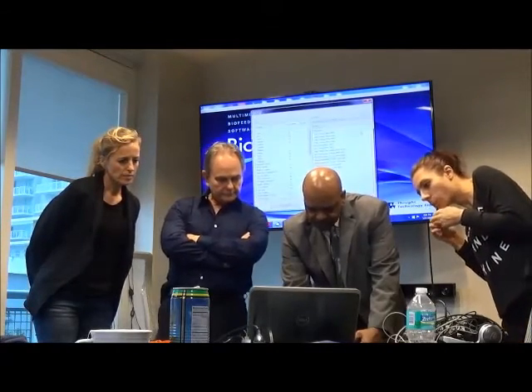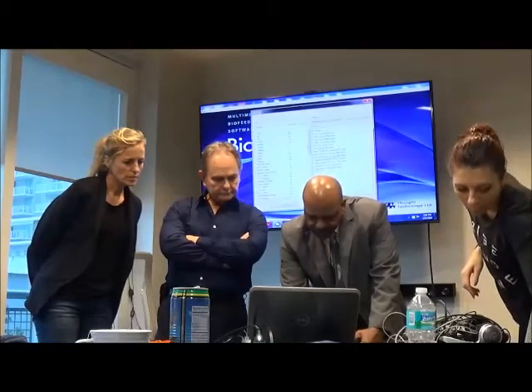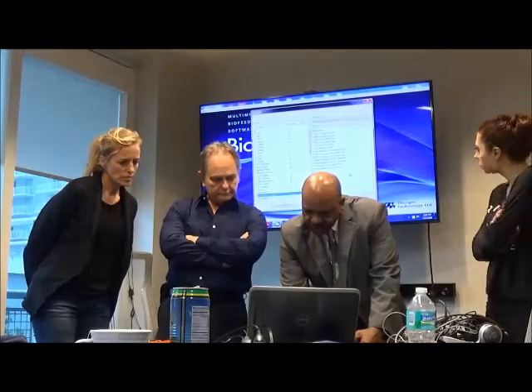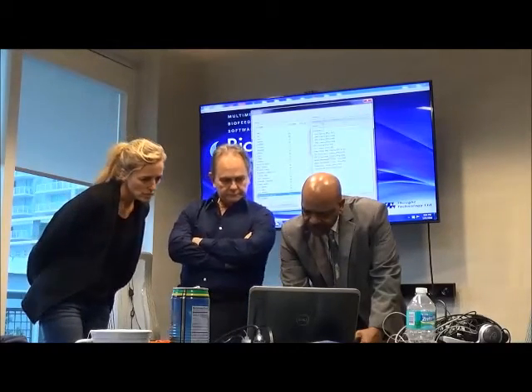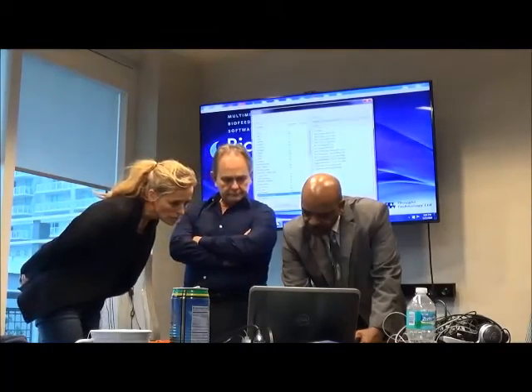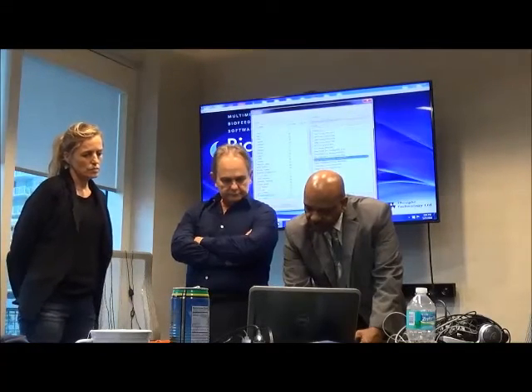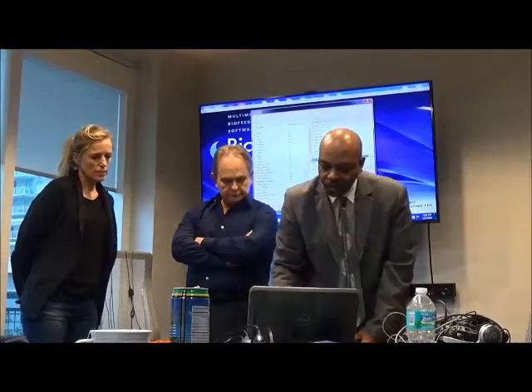and let's see, do I have the demo? Yeah, we'll call this one. And you see under the physiology suite, you see stress assessment, 14-minute. So that's the one. And we would just select OK.